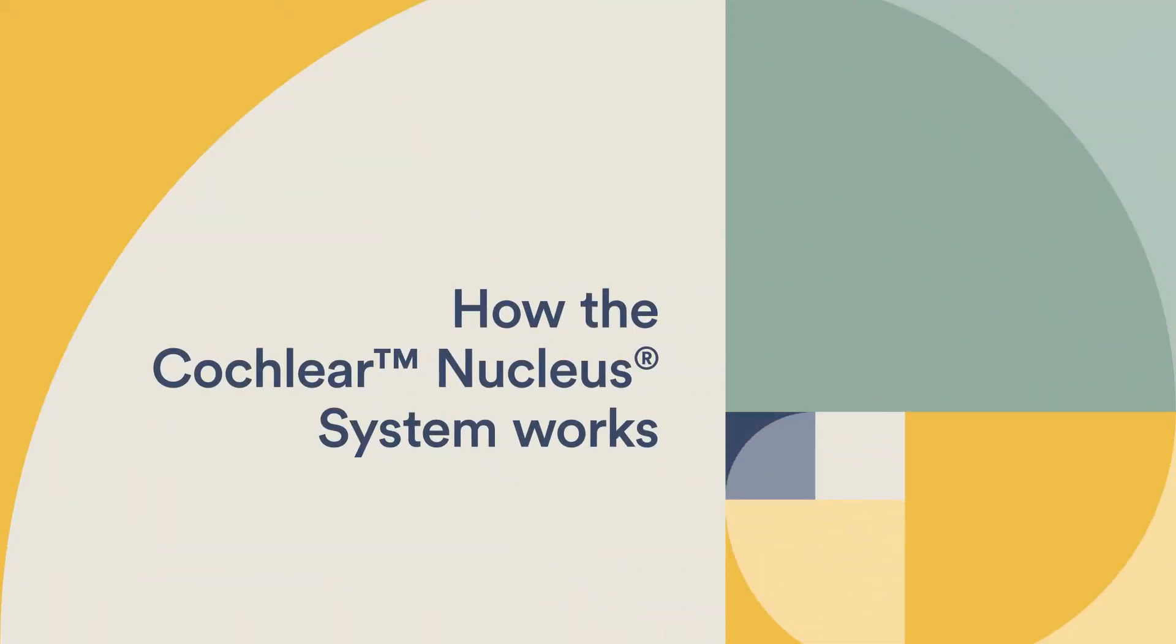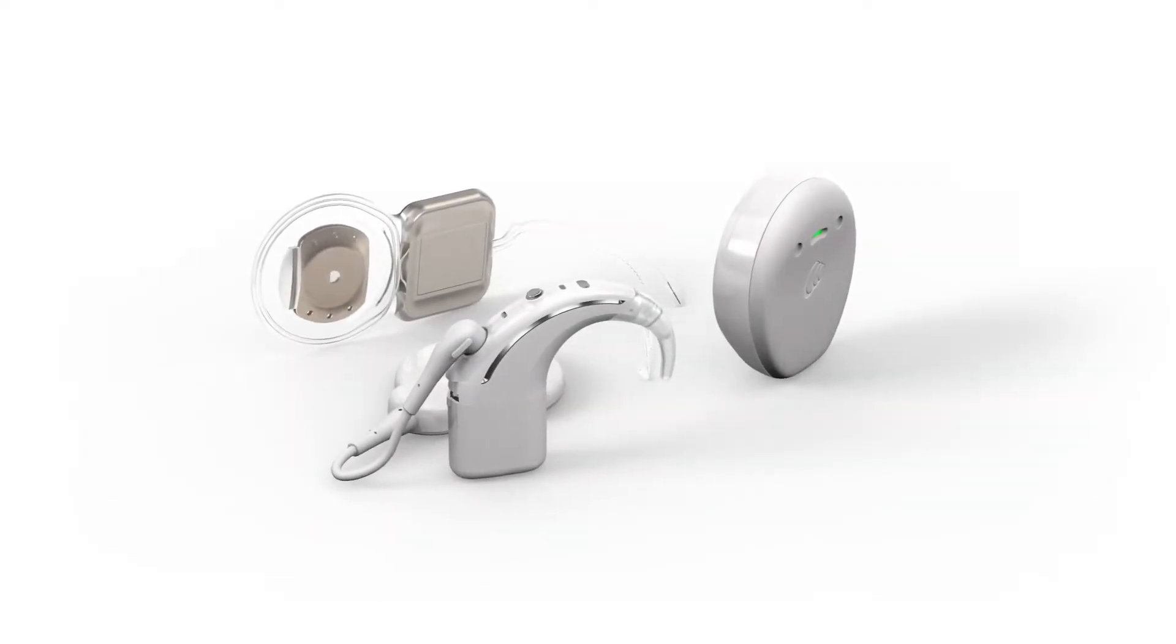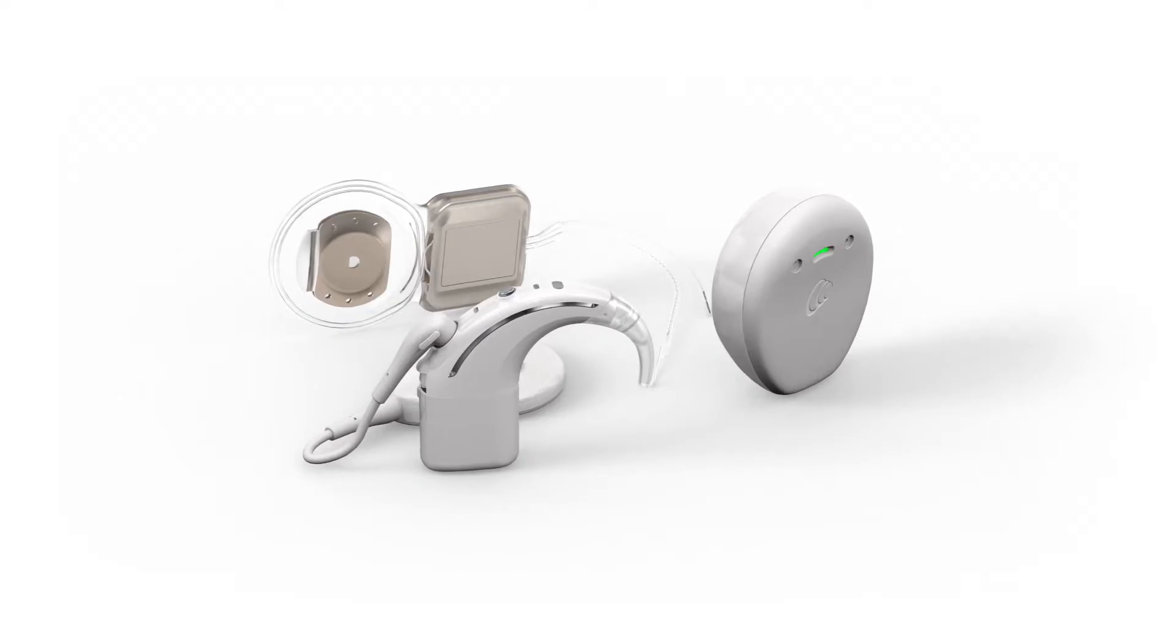How the Cochlear Nucleus System Works. The Cochlear Nucleus System replaces the parts of the inner ear that aren't working.